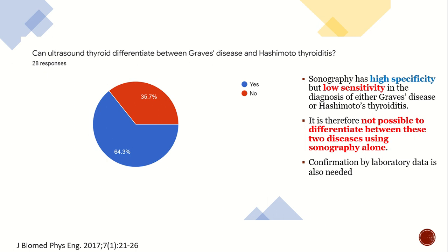Confirmation by laboratory data is also needed, but in practice we are not facing such scenarios unless the patient came to us with just a sonography image. Of course, we will wait for the laboratory.